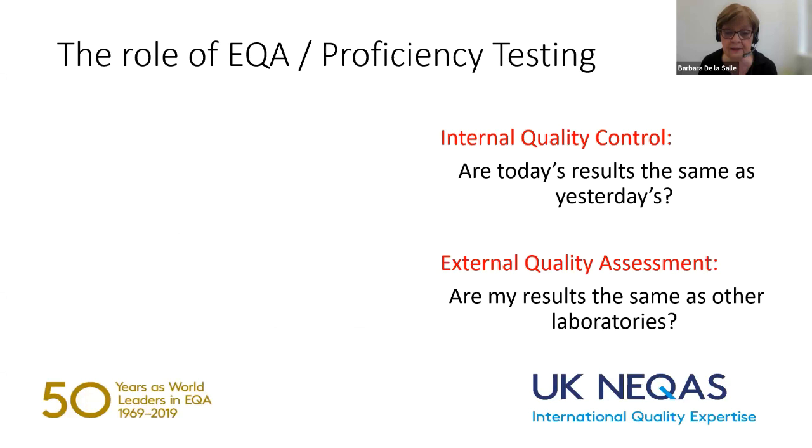I'm going to start with some basics because, as I said, we have been instructed that it is quite useful to keep going over some of these basic items for new staff. The role of EQA or proficiency testing, I'm aware that we have an international audience and both terms are used to apply to the same services, and how that fits in with the general performance management.